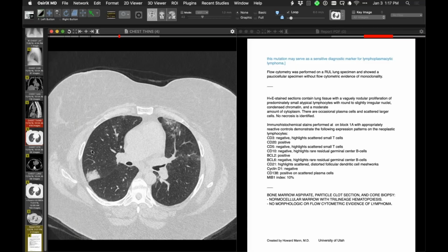Yeah. But I do have a low threshold for going to the medical record, and I'm pretty lucky that I can often get there. And by the time I read the radiograph, often I can get some information. And if it isn't a very clear-cut sounding history for community-acquired pneumonia in the right age group, I'm very circumspect about making the diagnosis of pneumonia on the radiograph. I'm very comfortable saying even an opacity is present, its etiology is not apparent, and it should be followed up.